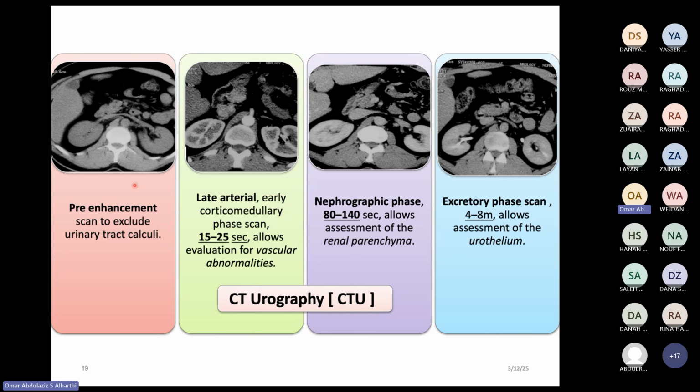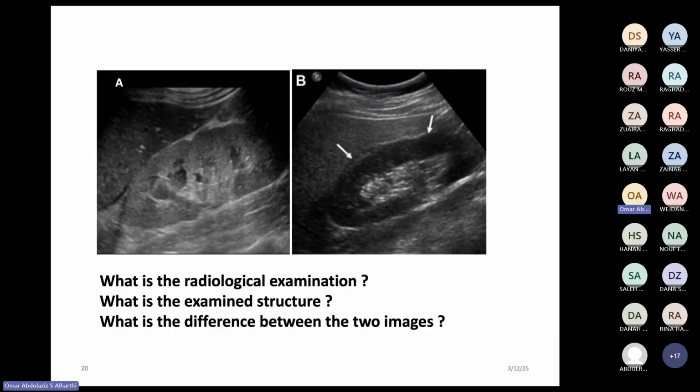So be aware it's 4 scans. It is equivalent to someone who is getting 4 different scans. So before ordering this exam, just be aware that the radiation dose is equivalent to 4 exams.